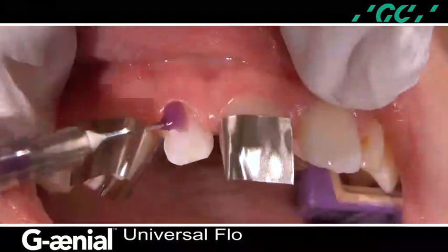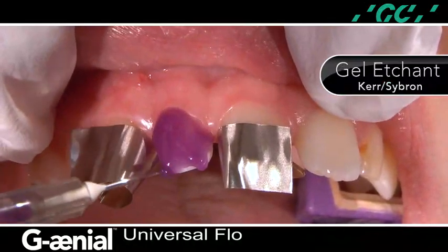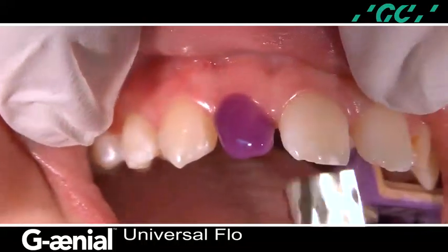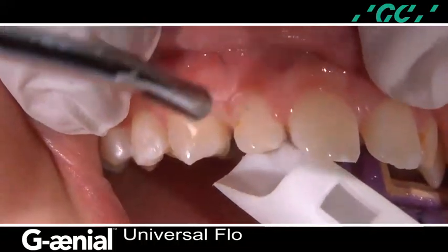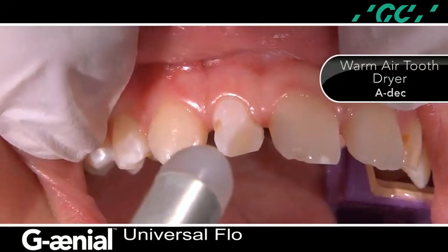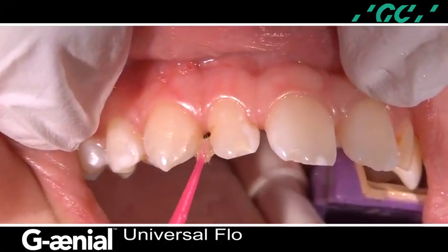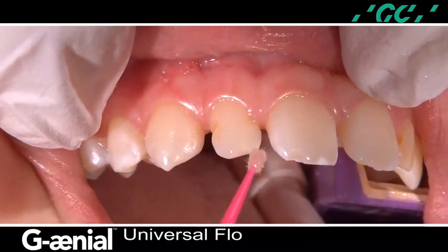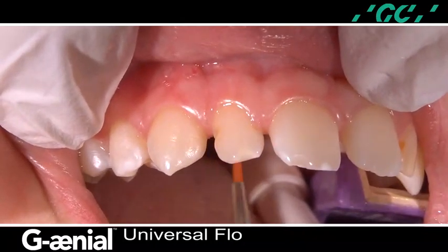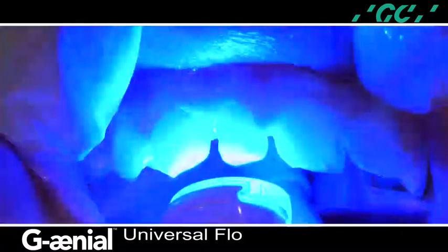The tooth is etched for 30 seconds with a 37.5% phosphoric acid semi-gel etchant by Kerr, and agitated with an applicator tip for 10 seconds. Rinsed for 5 seconds and air dried using an ADEC warm air tooth dryer. An adhesive was applied with an applicator tip and allowed to dwell for 10 seconds. Notice I also use a number 1 sable brush to eliminate any excess resin and air thin to ensure a uniform distribution of the adhesive and light cure for 10 seconds.